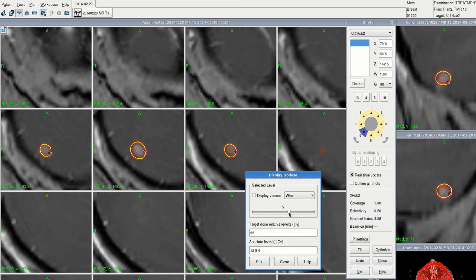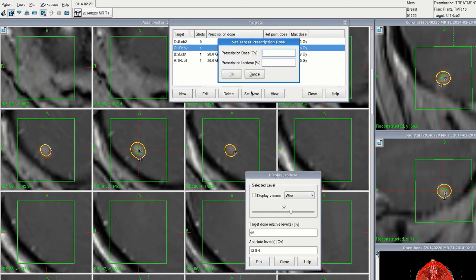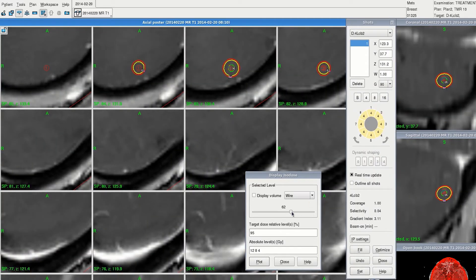And the third lesion — 62 percent looks like a good fit. So we plan 20 gray to the 62 percent isodose.